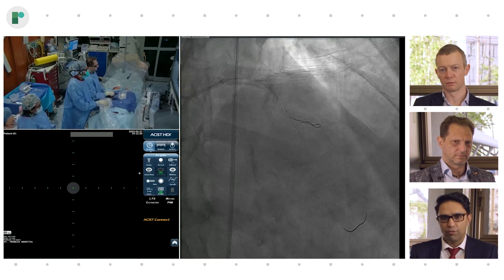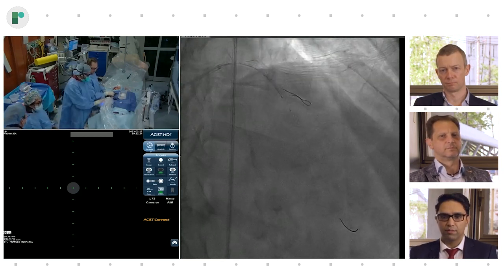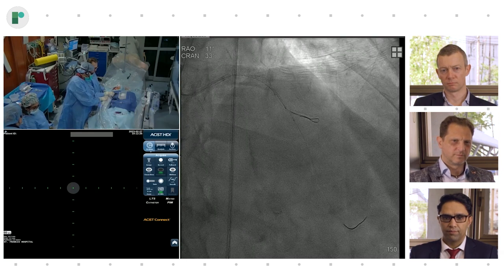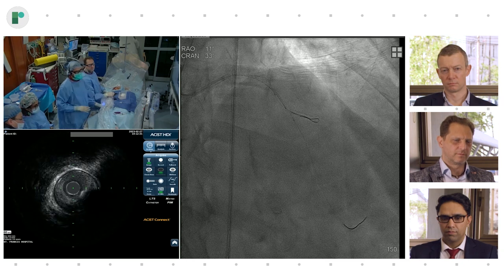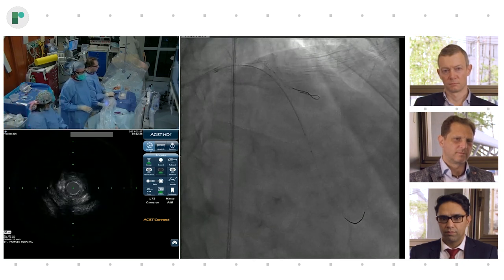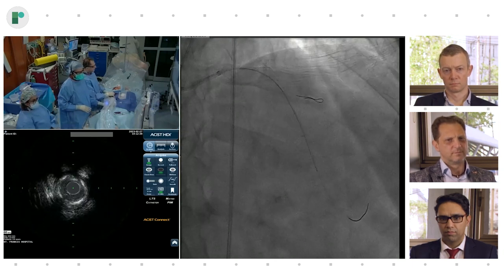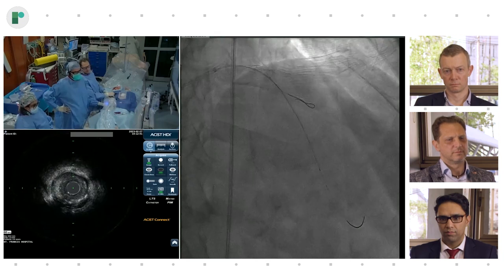If you just focus on the video for a second, we'll go through that algorithm that Alan just mentioned about going distal and proximal. Directly on the IVUS, there's a button that looks like a Wi-Fi button. I go ahead and press that, and he's conveniently right in the middle of the plaque. Okay, crosses without any difficulty. There's the lesion. So now the trick is finding a landing zone in the kind of diffusely diseased vessel.